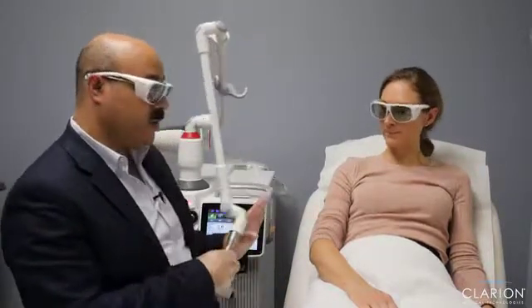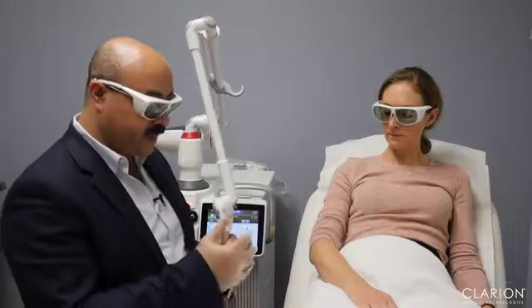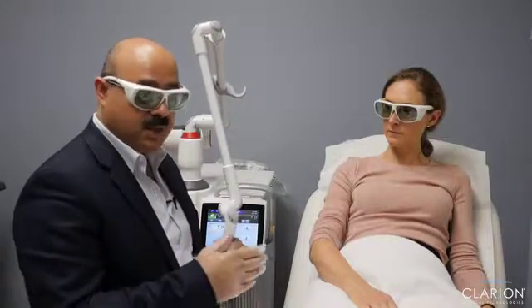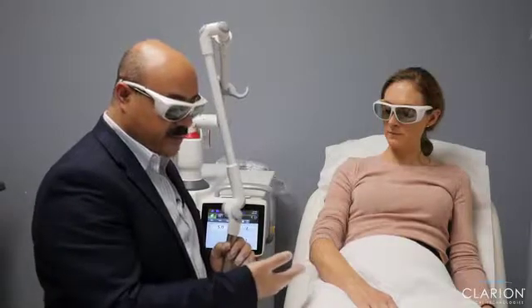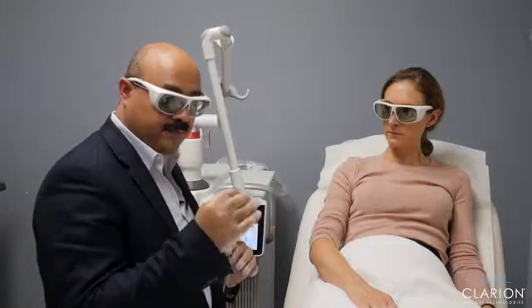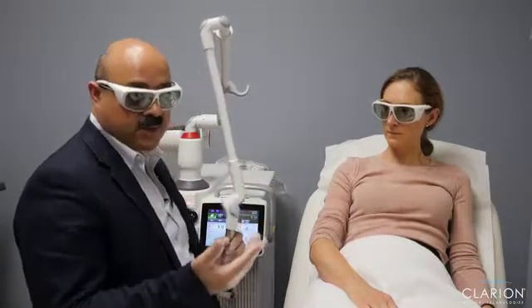Okay? So what we are going to do now is a resurfacing for another area, covering the whole area. Maybe it's not going to get rid of all the freckles from one session, but when we have such widespread freckles, we cannot go after them one by one. In this case, we have to do resurfacing, and we are going to aim at ablating the superficial layers of the skin in order to clear the pigments out. And this is what we are going to do.